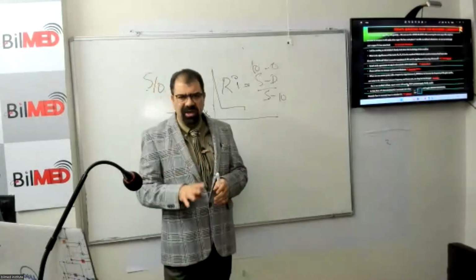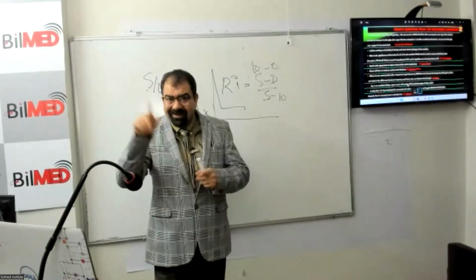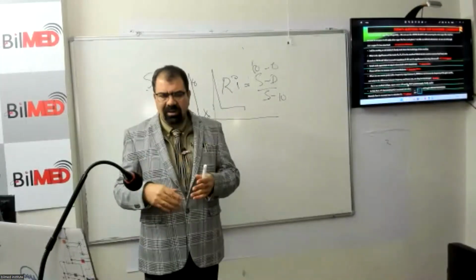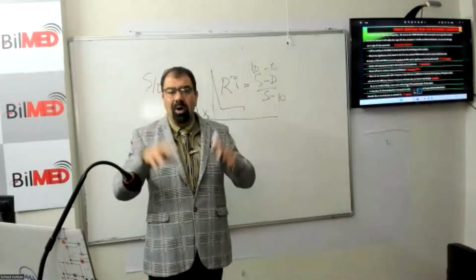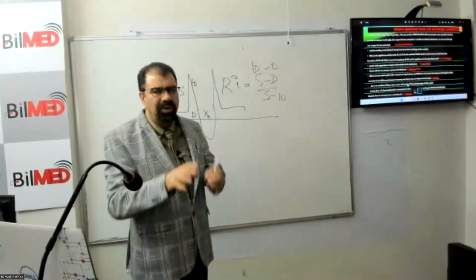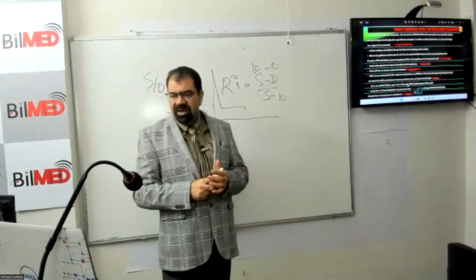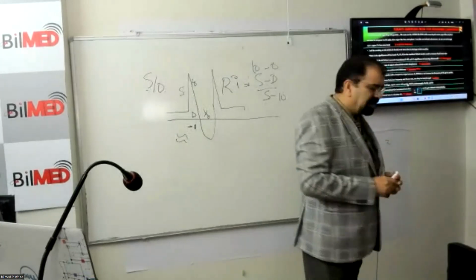And if it is reversed, then it is S minus D, where D is already minus. Now you put your maths over there and you will get puzzled. The formula is not working here. So whenever there is reversal, do not take the S by D ratio and do not take the resistive index. Okay, so these were the questions posted by our registered candidates today.